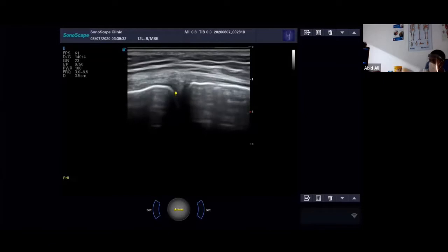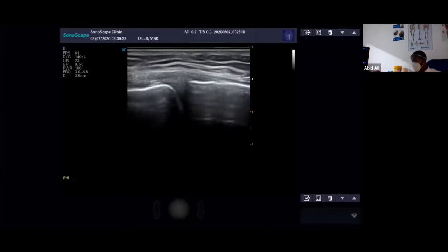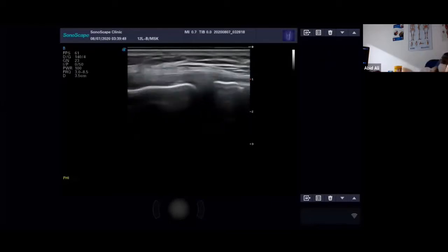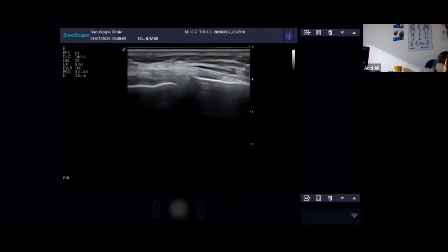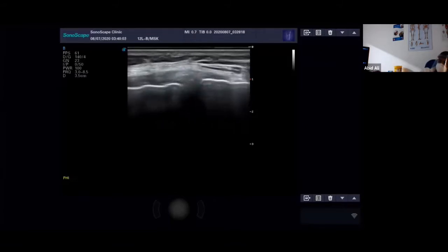Again, effusions are just fantastic to deal with when you have ultrasound in hand, because you'll just put your needle straight into that effusion. You can tell if you've got it all or not. One thing you will notice is if you have got a lot of fluid around the knee, it makes visualization of all your structures really nice, because fluid's a really good thing with ultrasound. It allows you to look at things in a lot more detail.